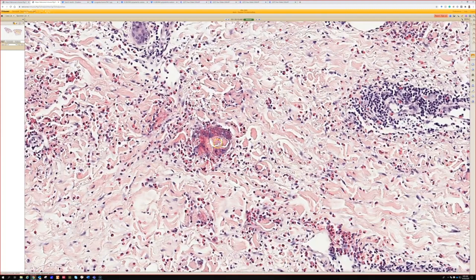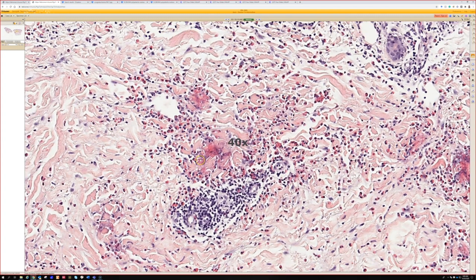When you have numerous eosinophils, they begin to degranulate — the collagen kind of dies and gets coated in the granules. We can't really see the granules here on this scan as well as you can when you flip a condenser on a light microscope. But all this bright flame stuff is eosinophil granules coating the dead and dying collagen bundles.